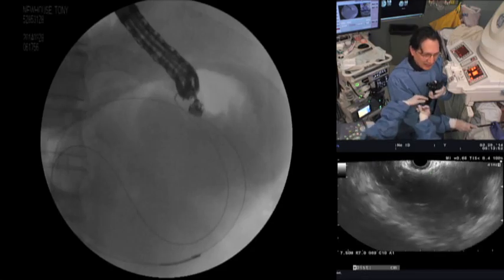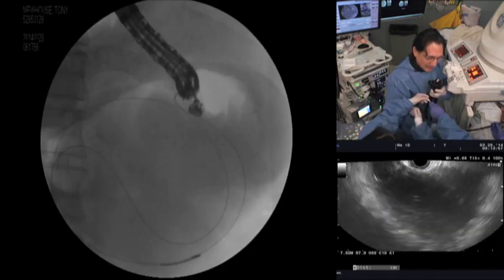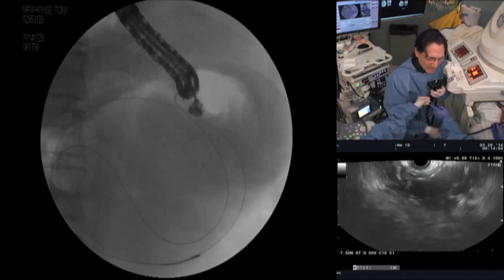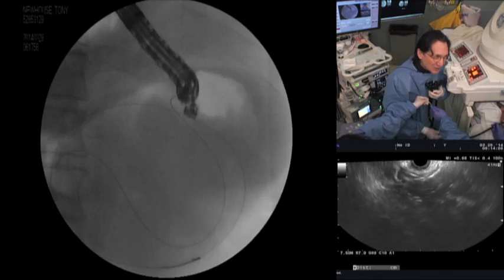The cystotome had the same bend when you went in, eh? Did you push in a little bit? Are you just pulling back now, or? Cystotome is now completely removed. Okay. And I have only the guide wire in place. But I do have that funny turn there. Do you see that turn, Paul? There's a little bend. Yeah.